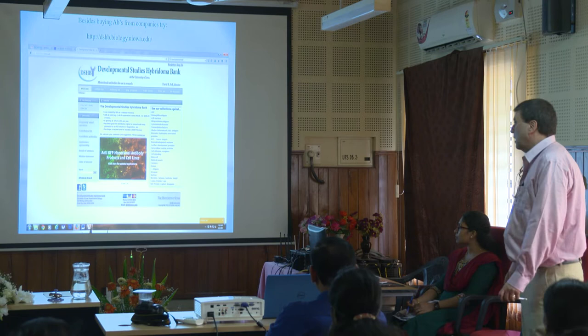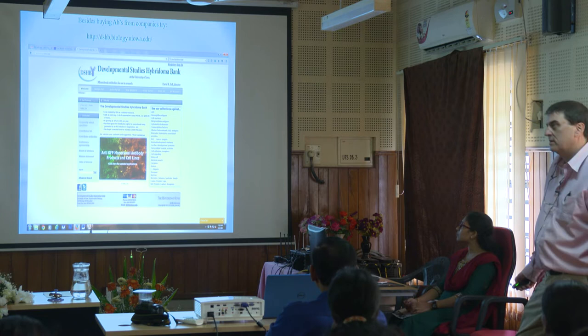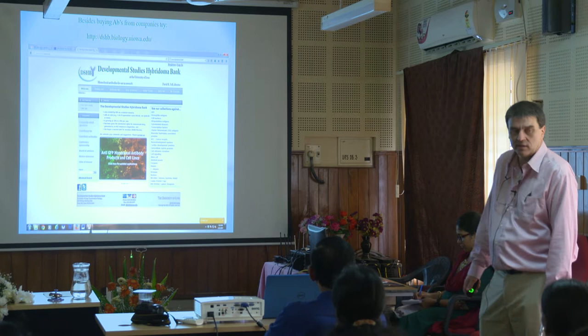Okay, now this is pretty nice. I don't see why you couldn't access this in India either. Years and years ago, we worked with an antibody called CSAT. It was against the beta-1 integrin in the chicken. I think it was actually made against chicken, if I remember correctly. But this is a nice resource called the Developmental Studies Hybridoma Bank. People who've worked with the NIH and had grants deposit their antibodies to this group. I think it's a hybridoma bank, so it's all monoclonals.